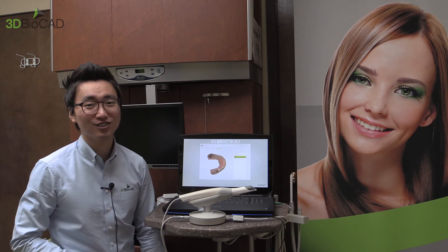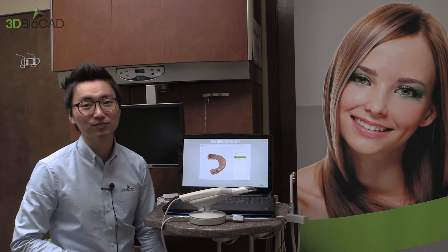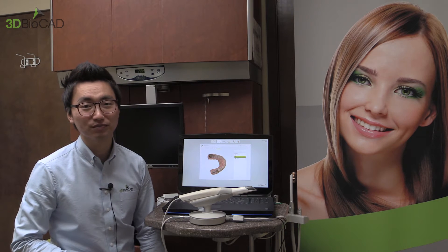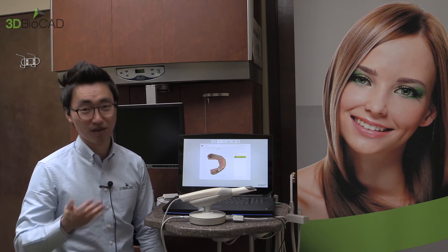Hello 3D by K viewers, this is Charles. I would like to use the 3Shape Trios and scan the full mouth. Hopefully with this video you can scan quicker, faster, and better.